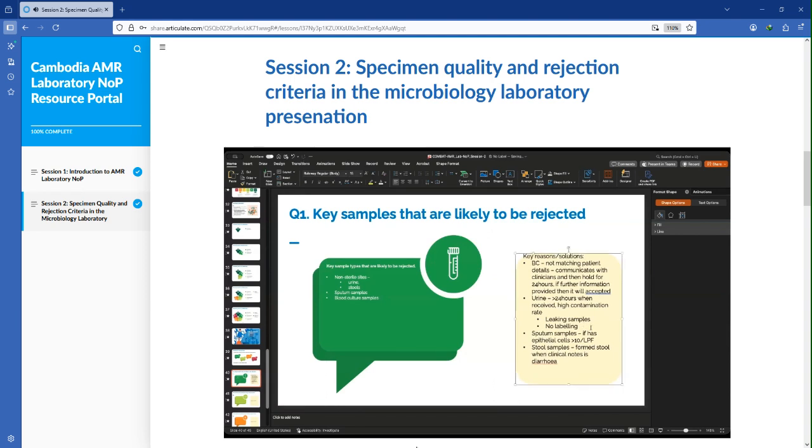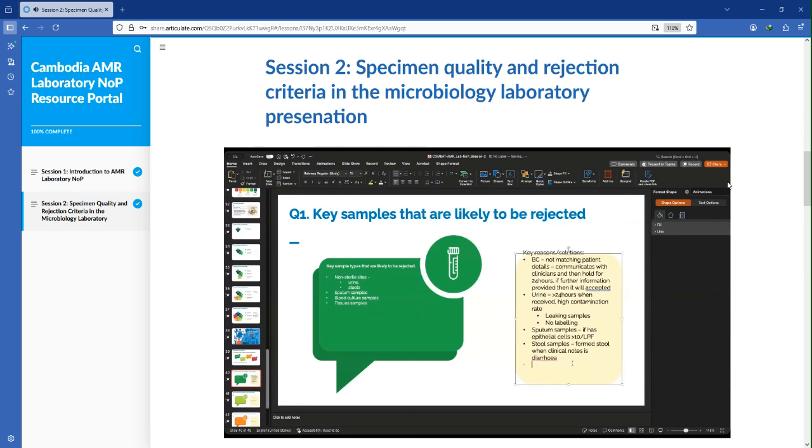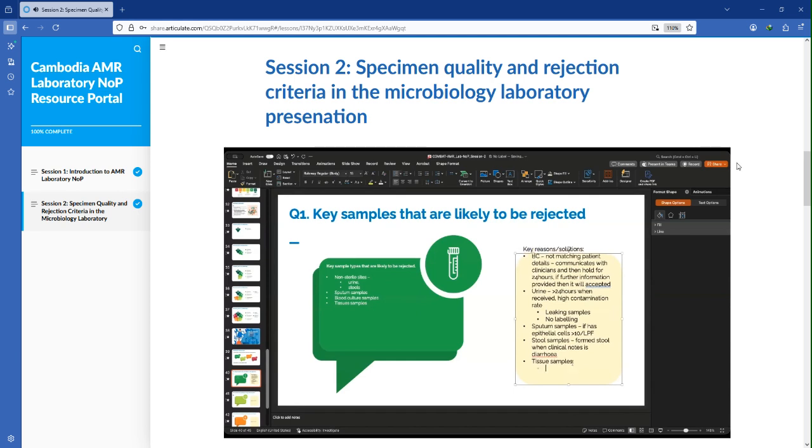We found it from the operating room, where a physician put it in the wrong container and added formalin solution to the sample. We also rejected it. As a current practice, after we get a rejected sample, we notify the ordering physician or nurse to recollect the sample and record it in the pre-analytical record form for documentation.